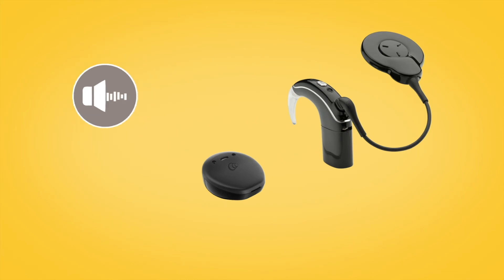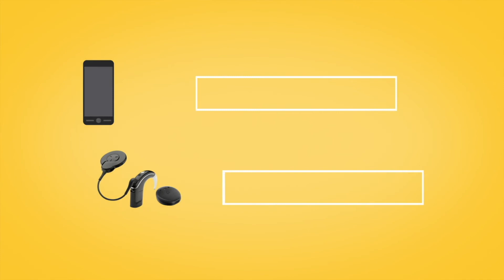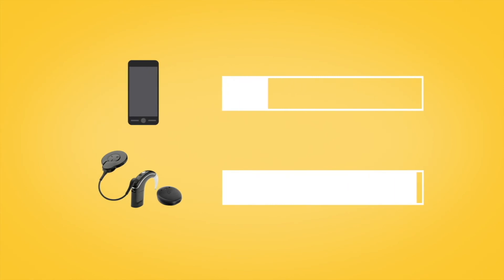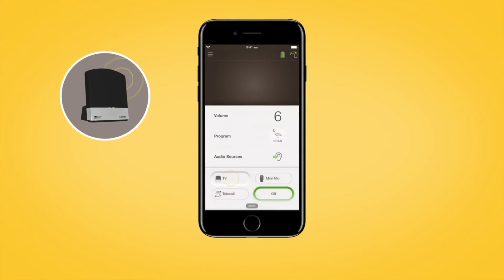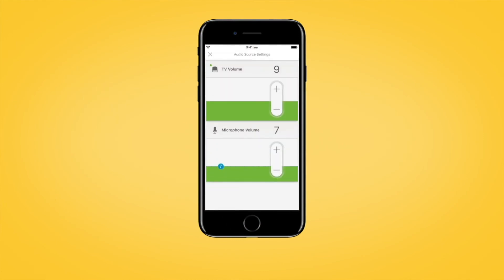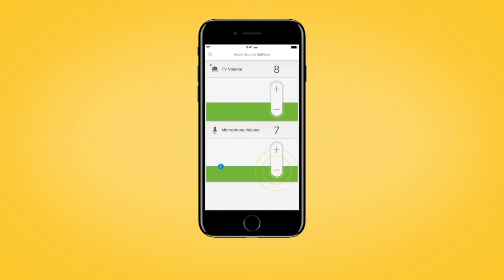The Nucleus Smart App also allows you to separately adjust the volume of streamed audio and sound from your sound processor microphones. To do this, first start streaming from an audio source, then tap more to open the audio source settings. You can then tap plus or minus to change the settings.